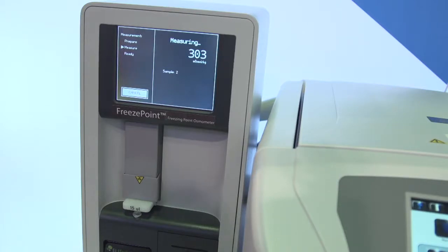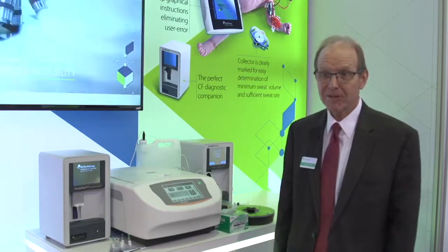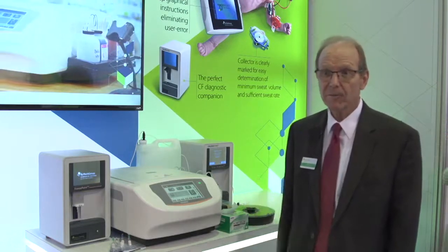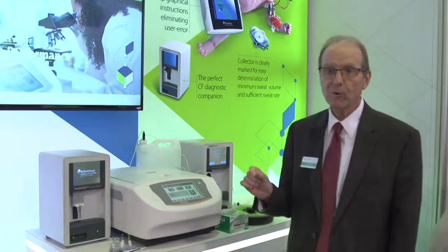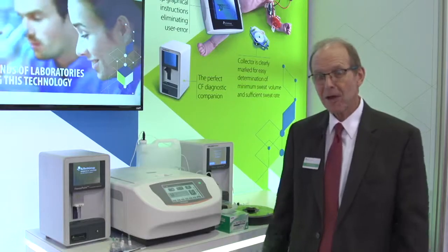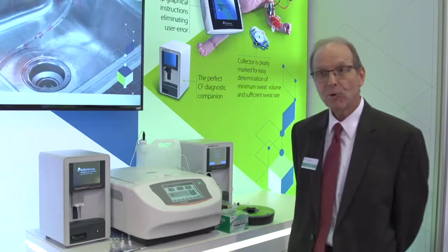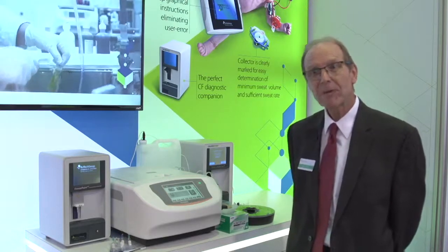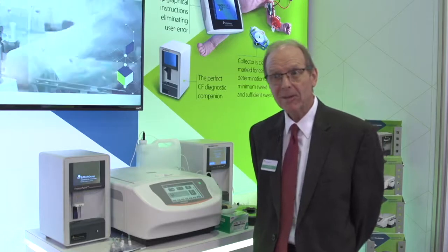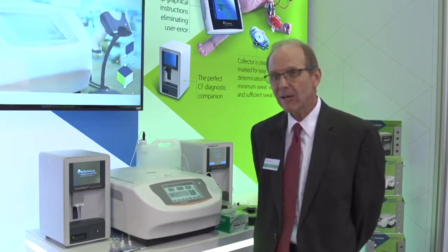The main advantages of the freeze point osmometer are that it allows the customer to work with an instrument that doesn't need a lot of babysitting. It is very easy to use, easy to calibrate, and not time consuming. You're not locked into expensive products for cleaning and maintaining the instrument. Laboratories are facing fewer employees, so they can't spend as much time with each instrument — they want instruments that don't require a lot of babysitting. This is one of those instruments: quick turnaround time and easy to calibrate.